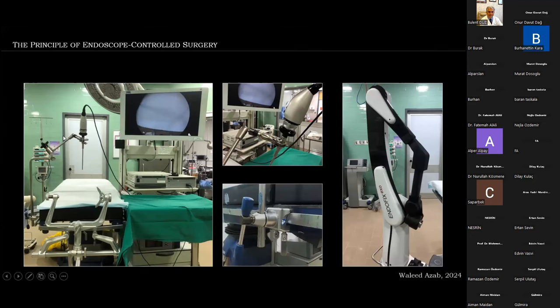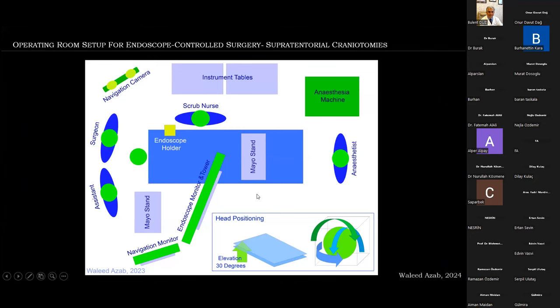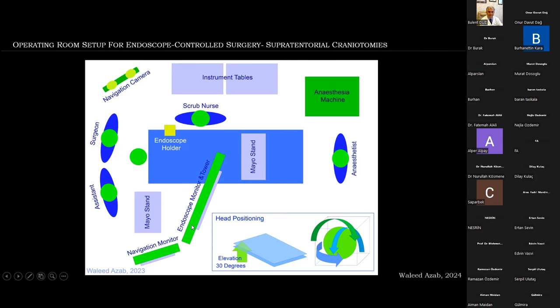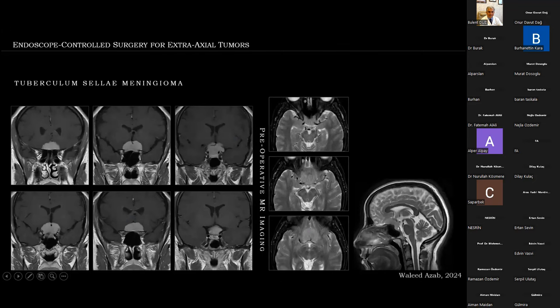Endoscope-controlled surgery is performed through keyhole openings, completely dependent on the rigid micro-endoscope. The endoscope can be held in a mechanical holder, pneumatic holder, used freehand by the assistant, fixed to a semi-robotic arm, or a robotic arm. Here is the operating room setup I use for the majority of supratentorial craniotomies — the surgeon is here and the endoscope monitor is positioned in that direction. For retrosigmoid and posterior fossa approaches, the endoscope monitor is put across the table.